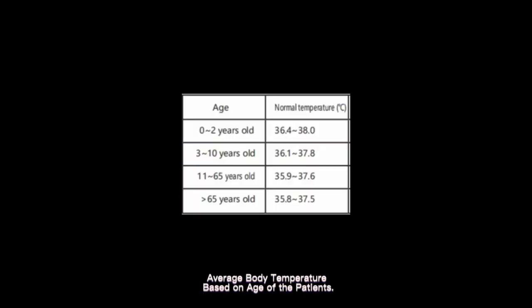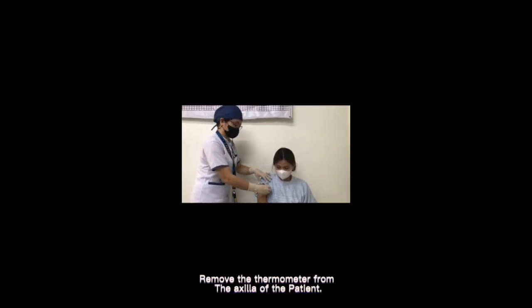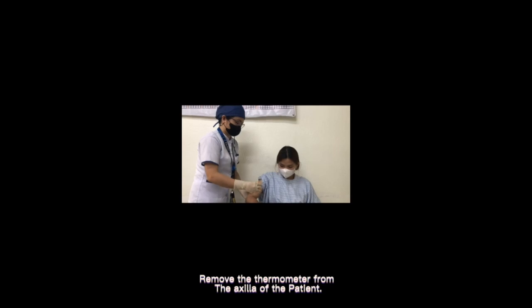Here is the average body temperature based on the age of the patients. Now remove the thermometer from the axilla of the patient.